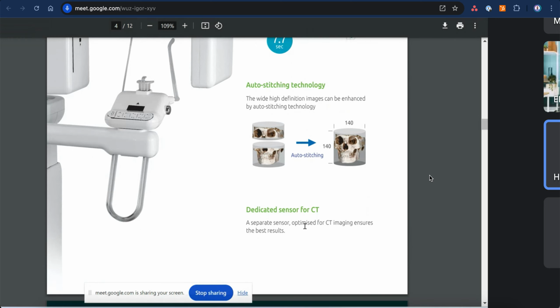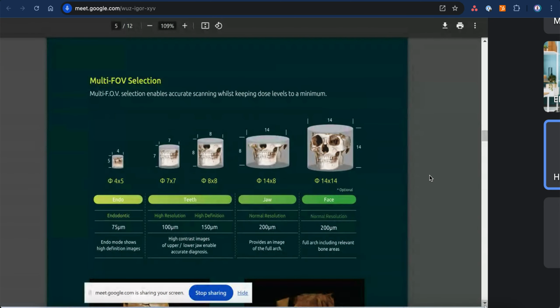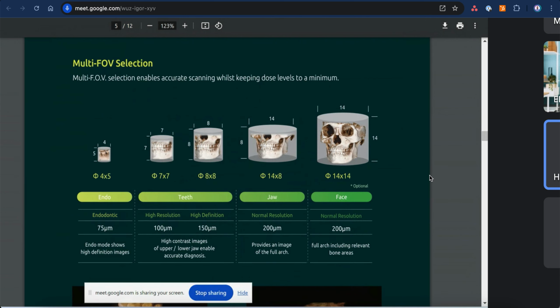This is here a specialized sensor for CT imaging, to ensure the best result. Now companies are so proud of how small a field of view they can get. Like here we have 4 by 5 dimensions. Other companies, for example, can have 4 by 4 dimension. Also below 5. There are more advanced companies that can have 4 by 4. Also you have, for example, this 4 by 4, I want just for a single tooth.